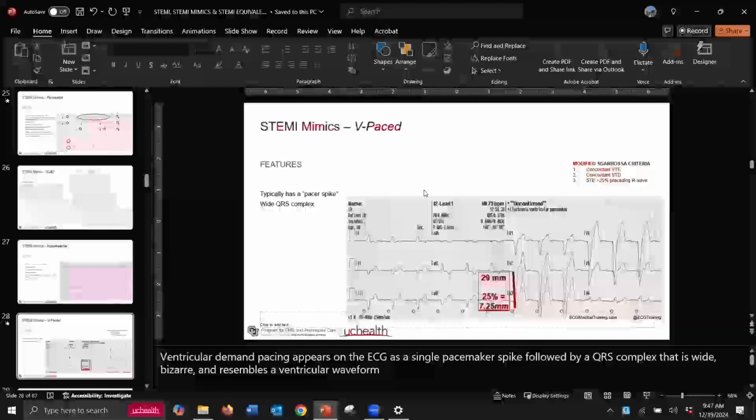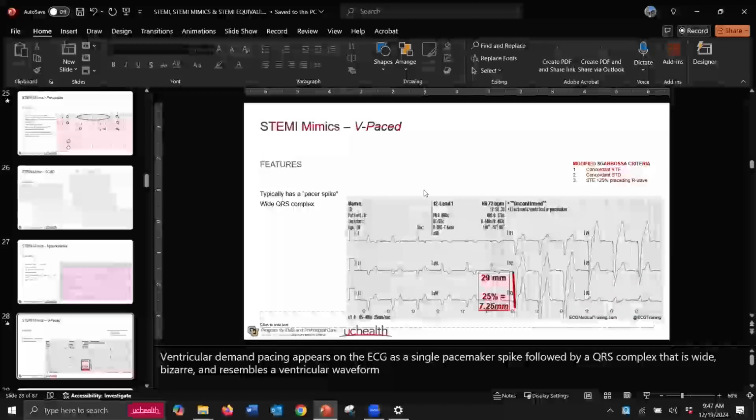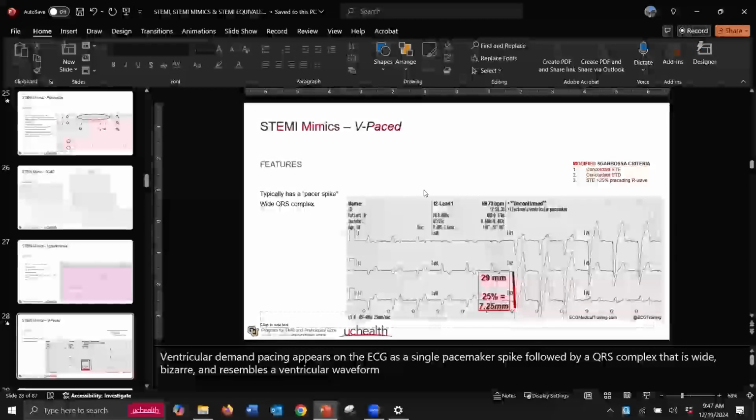So as we're pulling into the emergency room, after I've called a cardiac alert, after we ran him in emergent, we damn near IO'd Grandpa. I decided a good paramedic would hit print and print that 12 lead. And it's on a LifePak. I love LifePak, kind of, sort of, sometimes. What I hate about LifePaks is you don't see pacer spikes. But on a 12 lead, you do see them, magic arrows.